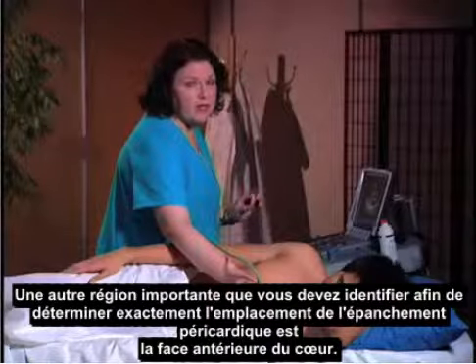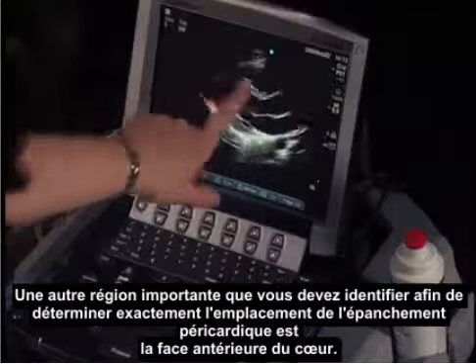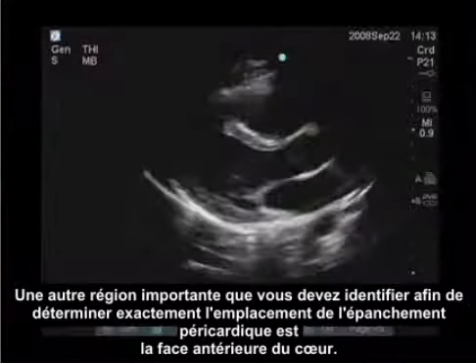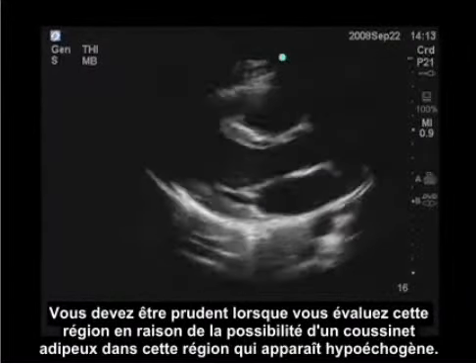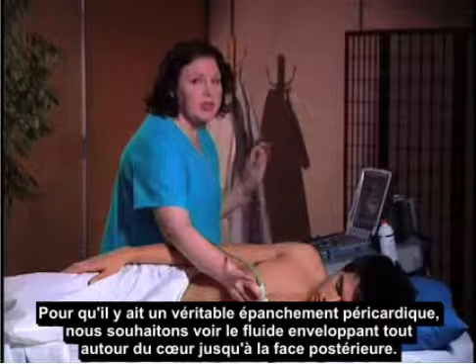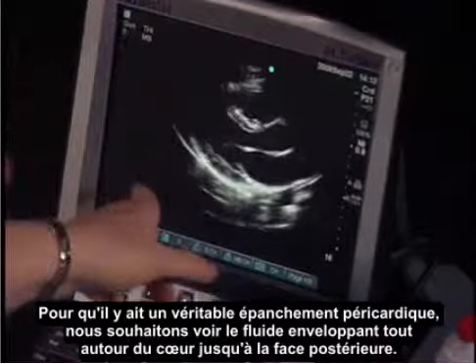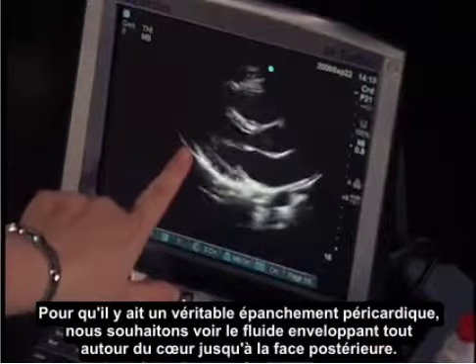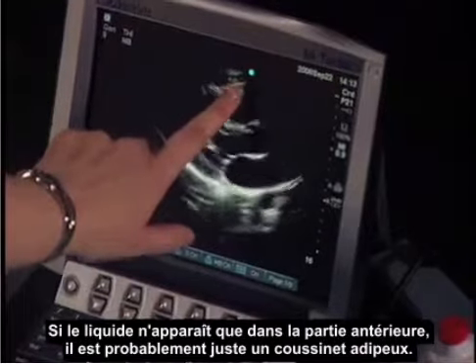Another important area you have to identify to determine exactly where the pericardial effusion is the anterior aspect of the heart. You have to be careful when you evaluate this area because there could be a fat pad in this area that appears hypoechoic. So for it to be a true pericardial effusion, we want to see the fluid wrapping all the way around the heart to the posterior aspect. If it's just here in the anterior aspect, it's probably just a fat pad.